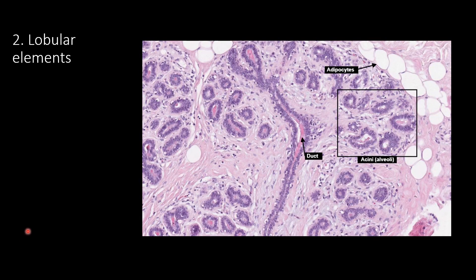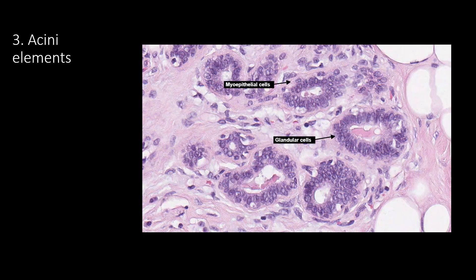Zooming in on one of those lobules, we can see the lobular elements — some adipose tissue, the duct, and more clearly the acini. Taking a closer look at the acini, we can see glandular epithelial cells secreting pink proteinaceous material into their lumen, and myoepithelial cells forming a thin pink line lining the gland and helping to push out that proteinaceous material.